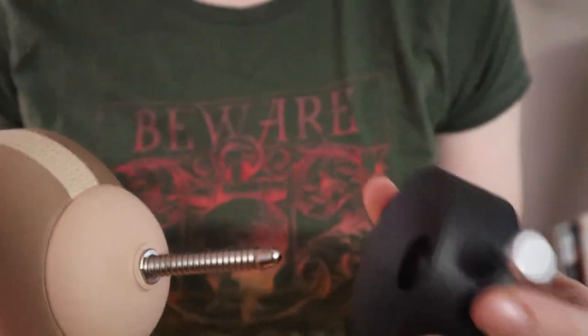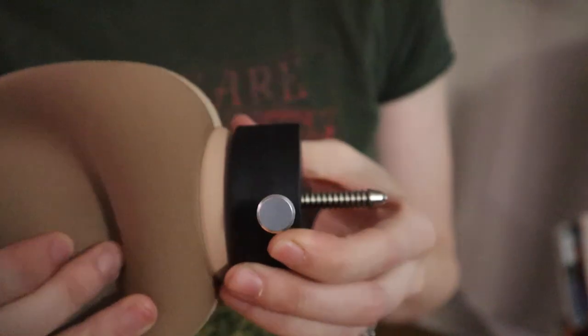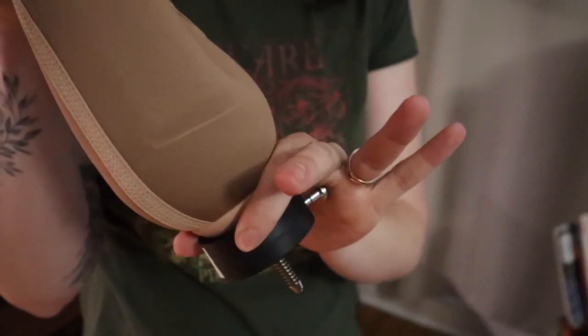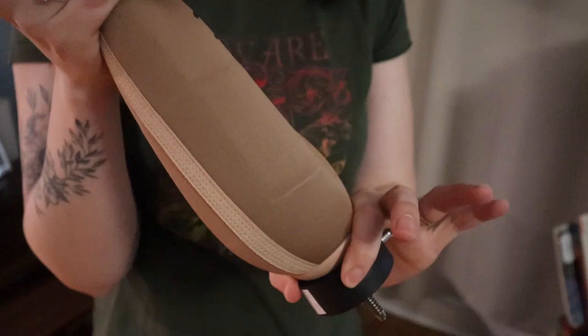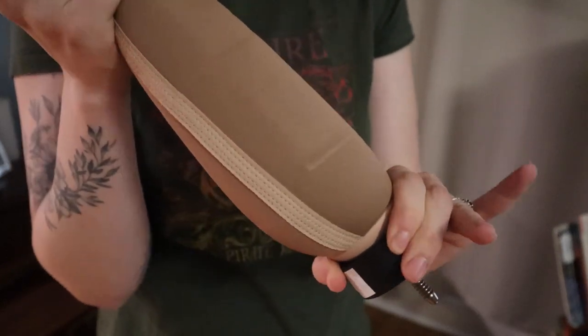The pin system, again, the pin is going to click into that lock. And then as you're taking a step, that pin is stuck in place, but you kind of have this almost milking effect as you're walking.